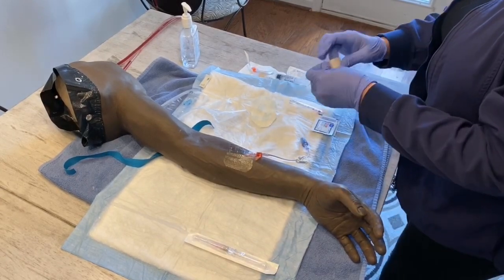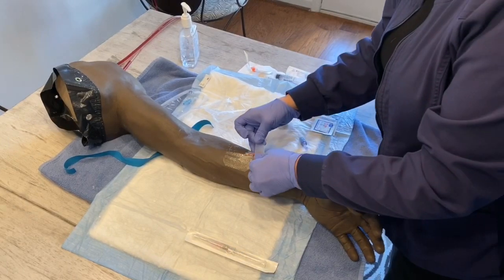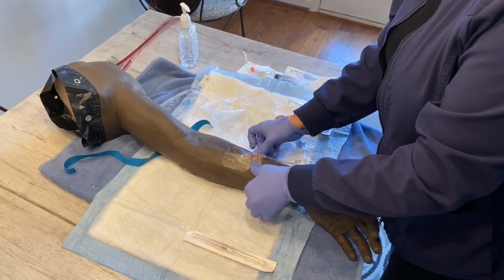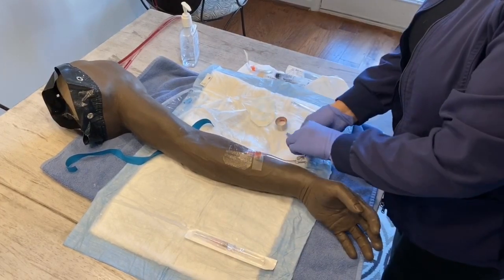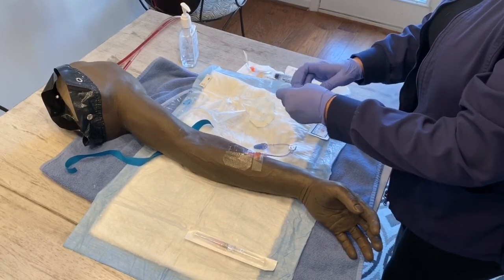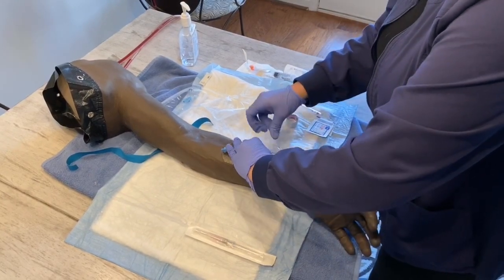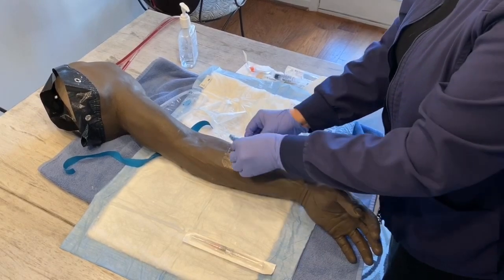Then I take another piece of tape. I want to make sure this is going to stay. And I don't want to necessarily go across there because I want to always visualize my insertion site. But I want to go across the hub of the connector so that it will be connected. Then we want to go ahead and loop the IV site up. And stabilize that and connect it and make sure it's secure to the patient.